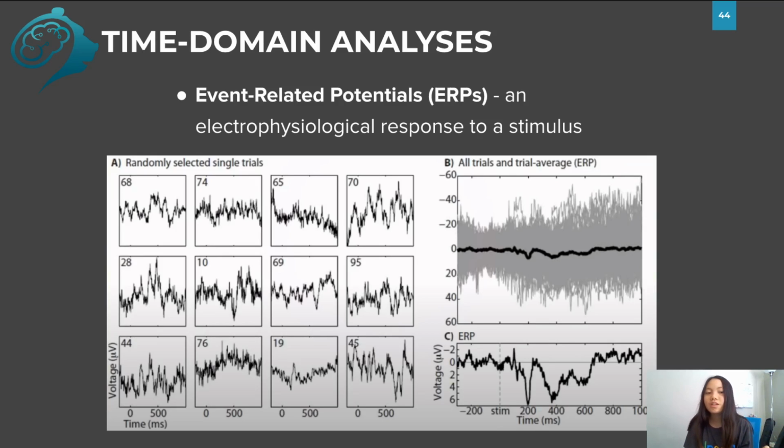of the signal. Alternatively, these fluctuations can be interpreted as important signals that could be relevant for understanding cognitive processes, and you can lose them in the time domain averaging. And the graph at the bottom shows the same ERP but more zoomed in, so you can see it in finer detail.